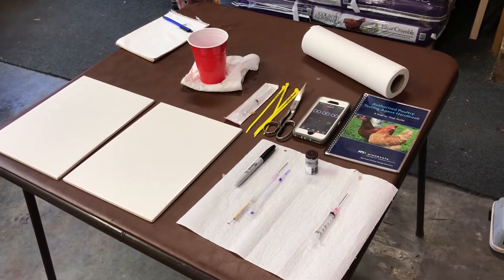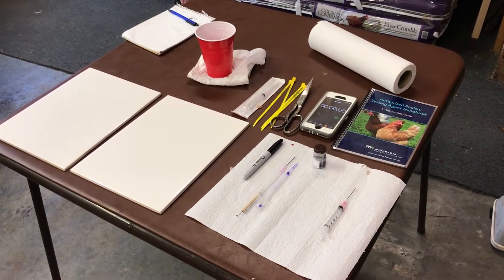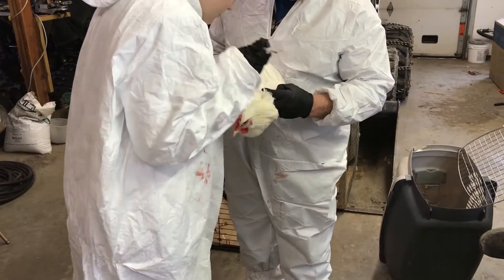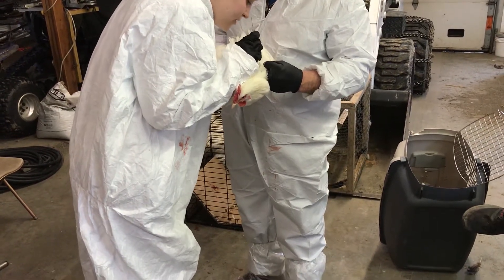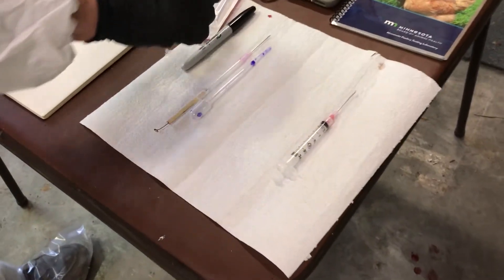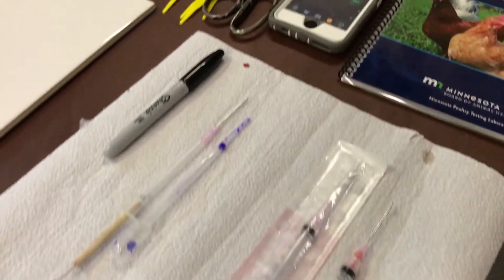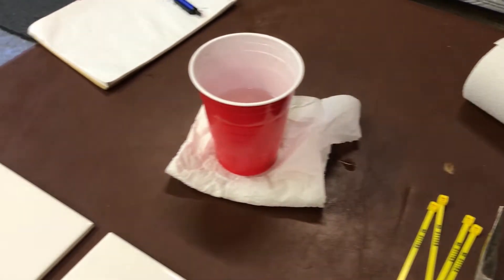The rapid whole blood test should be conducted in a clean environment away from the elements. The testing location should be at least 65 to 75 degrees and have good lighting, but out of direct sunlight and wind. You will need a table, clean working surface, a testing plate, a blood loop, a needle, antigen, water for rinsing and washing equipment, towels or paper towels, a timer, leg bands, scissors, and the test reporting form.